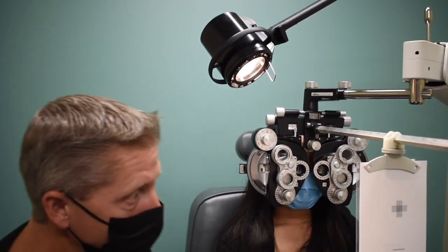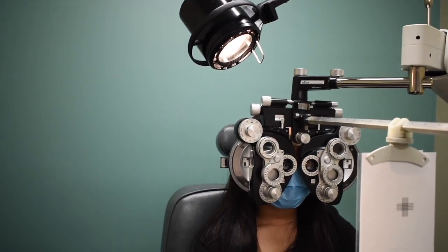While most patients who are non-presbyopic are going to be able to read some of the letters on that card, your incipient presbyopes or presbyopes, when you flip the reading rod down, are going to have some difficulty with those letters. Once you flip it down and shine the light on the card, the first thing you ask your patients is, can you make out any of those letters? Most of your incipient presbyopes, most of your absolute presbyopes are going to say maybe a couple.